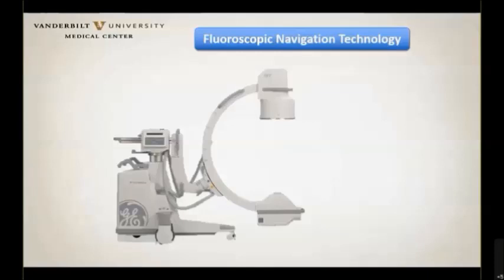The problem with radial ultrasound is that if you see the lesion, you've already successfully navigated there. So it's a great confirmation tool. It's not that great of a guiding tool. And so the same can be said of cone beam CT and to a certain degree of digital tomosynthesis, which is the fluoroscopic navigation technology I'm going to mention here, uncoupled with some readjustment by electromagnetic navigation. I'll go into details as to what exactly I mean by that.